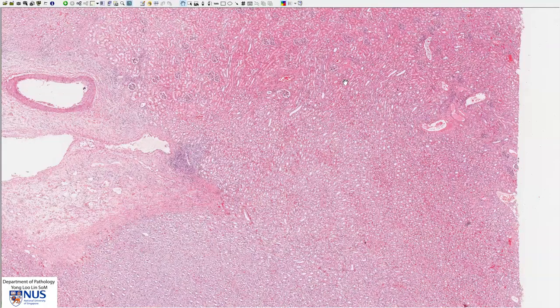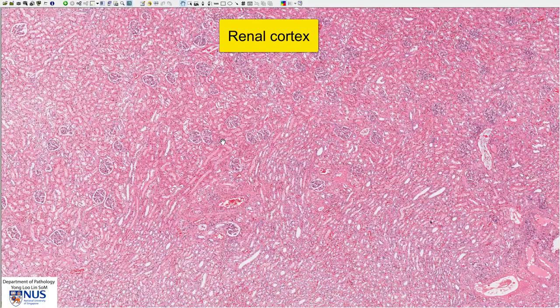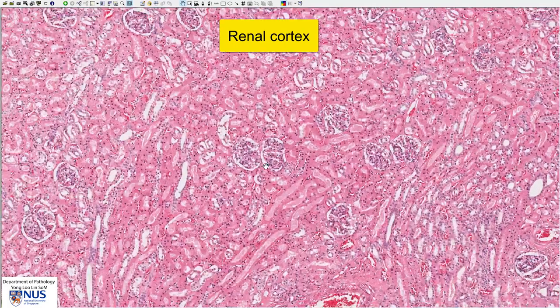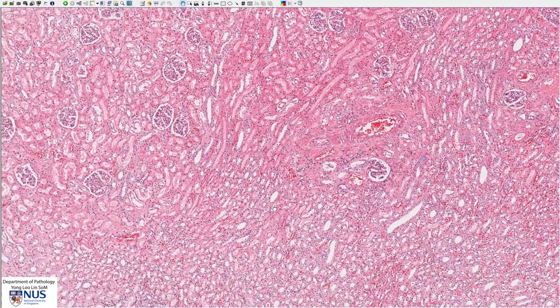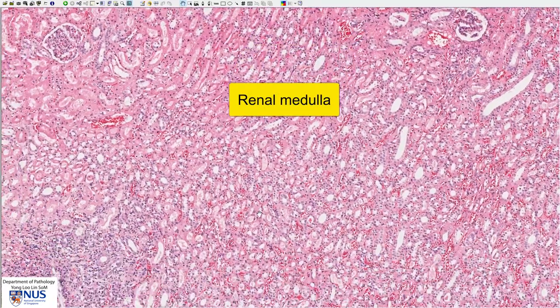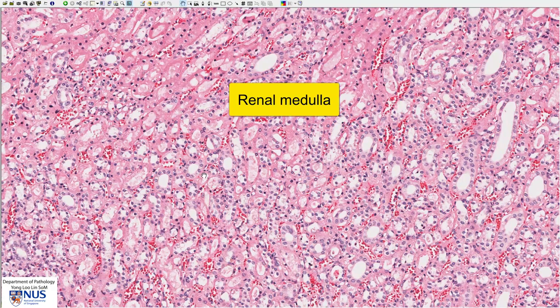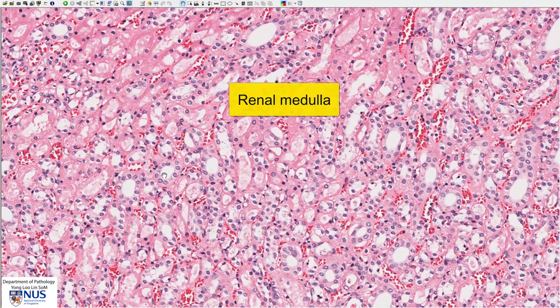This pink area is composed of normal kidney. In this region we can see the cortex, because there are many glomeruli dotted throughout. On higher magnification, we can see these rounded glomeruli, and in between them we have parts of the convoluted tubules. Moving to another region, this is the medulla of the kidney, which does not contain glomeruli but instead contains many tubules lined by very uniform cuboidal cells with some blood vessels in between. These will be the collecting ducts, as well as parts of the loops of Henle.